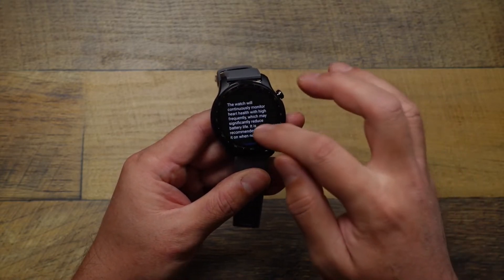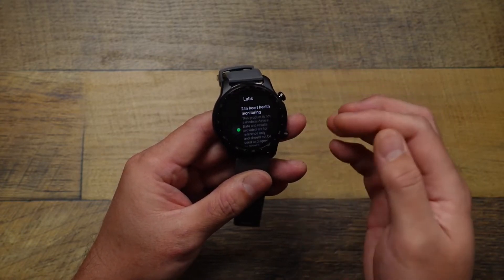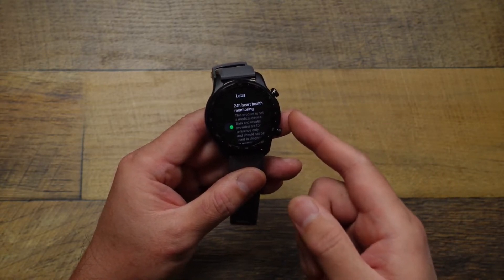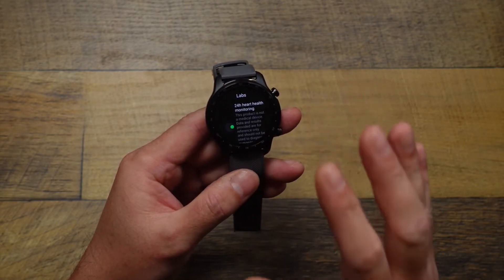It'll let you know that turning this on will reduce your battery life and consume more battery — hit Continue. The first time you do this it'll also warn you that it's gonna disable 24-hour oxygen and stress level monitoring, so just know that you're gonna lose those features by turning this on.